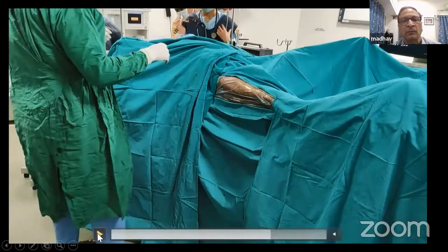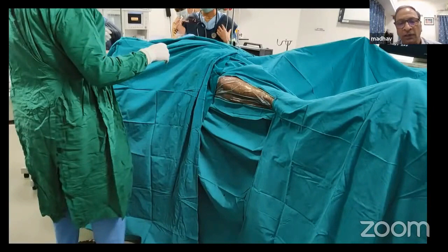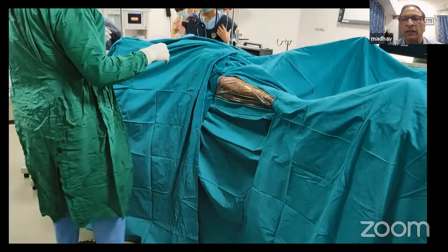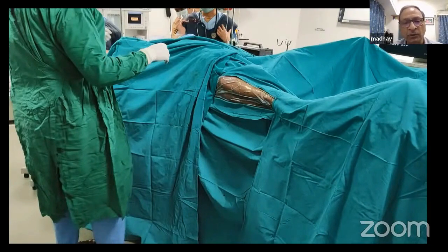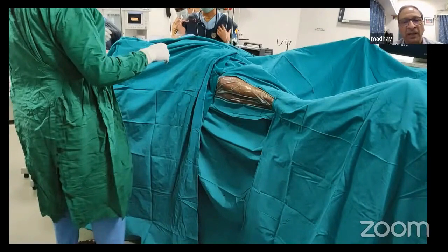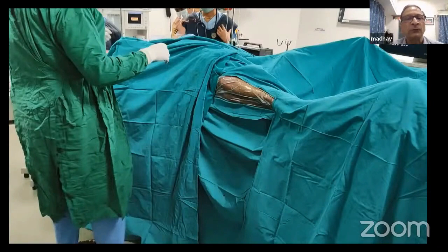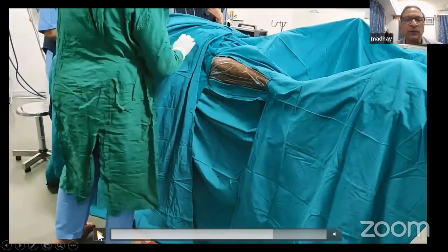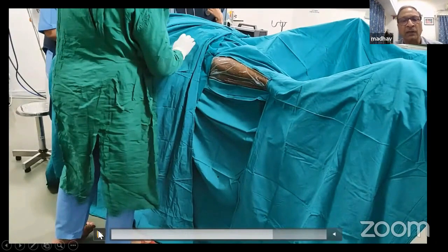This sheet goes from the body of the patient and flows down to the bottom of the table, almost to the floor. This is very important because when doing a lateral view of the hip joint with the C-arm, the C-arm comes in between the legs under the table — through a completely unsterile area — and then swings up to come into the lateral position to show the hip laterally. If this proximal sheet is not placed properly, it can move and the C-arm tube can come out of the sheet and contaminate your field while taking a lateral view.